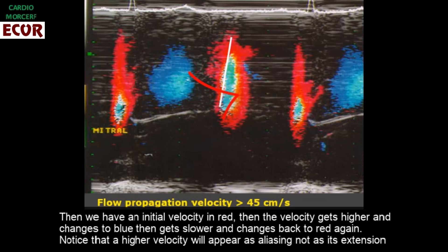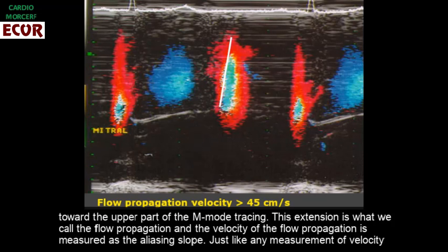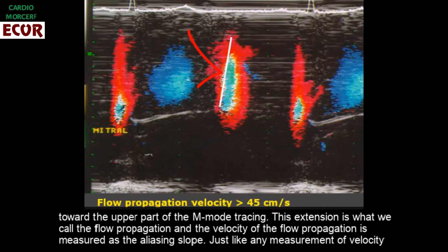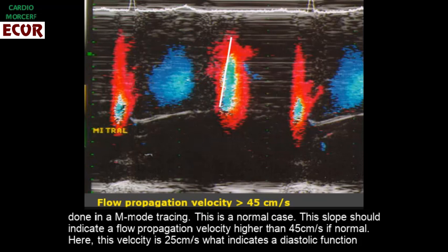Notice that a higher velocity will appear as aliasing, not as its extension toward the upper part of the M-mode tracing. This extension is what we call the flow propagation, and the velocity of the flow propagation is measured as the aliasing slope, just like any measurement of velocity done in an M-mode tracing.